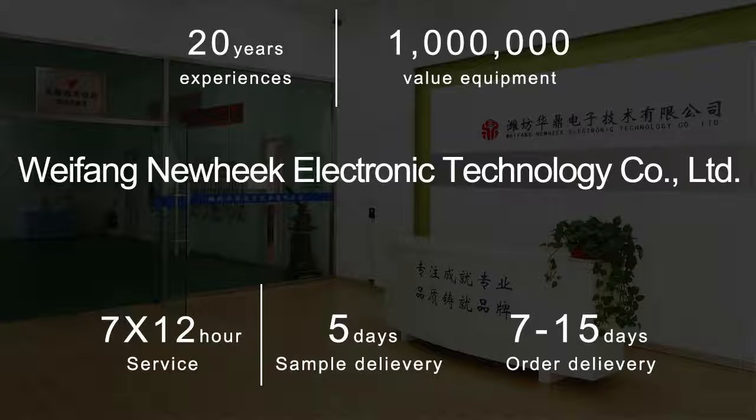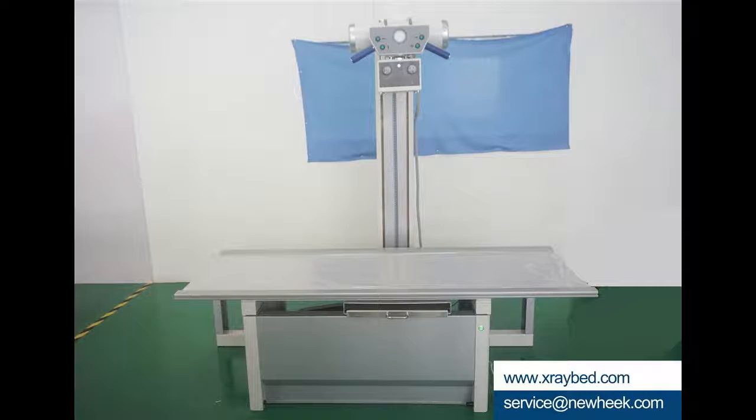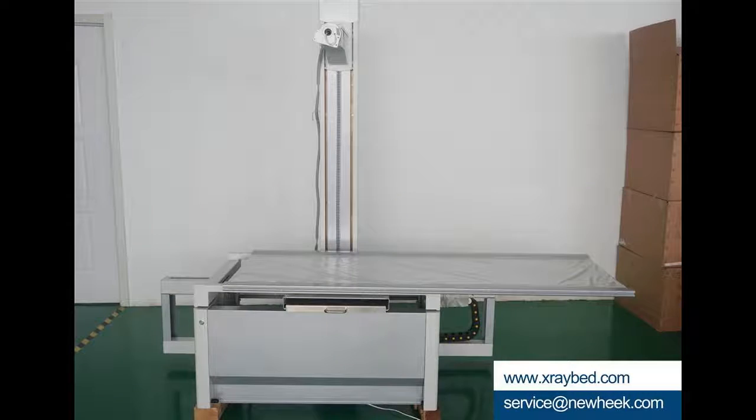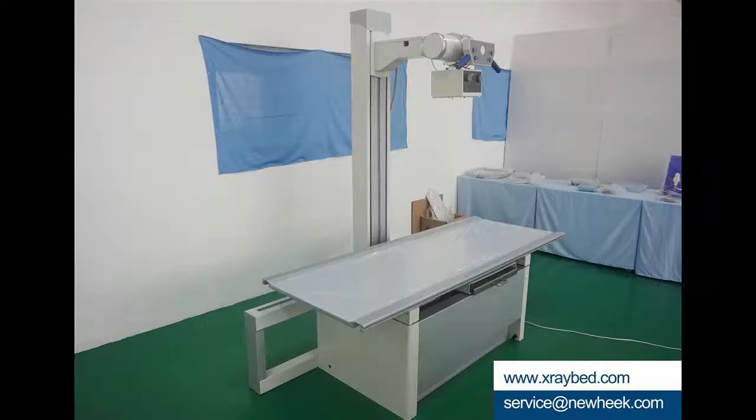The X-ray table can be used with an X-ray generator and radiator. It is suitable for standing, lying, lateral, and kilovolt photography of the human head, chest, abdomen, limbs, and bones in hospitals at all levels.